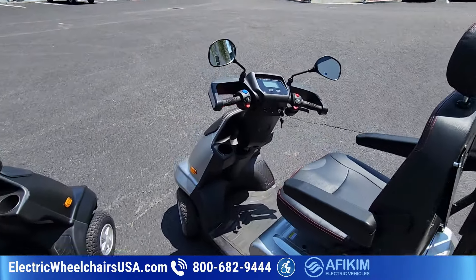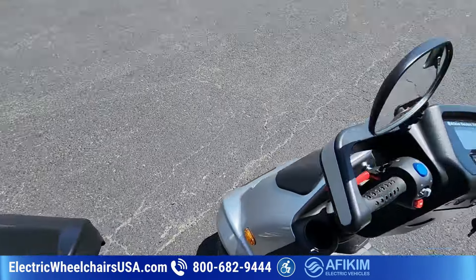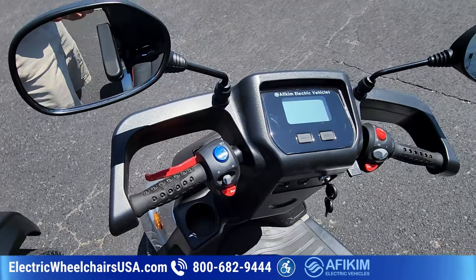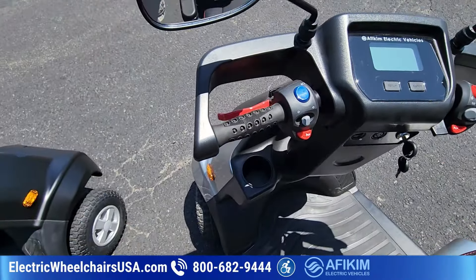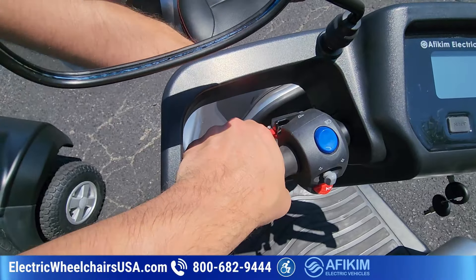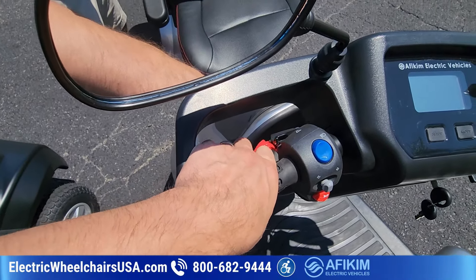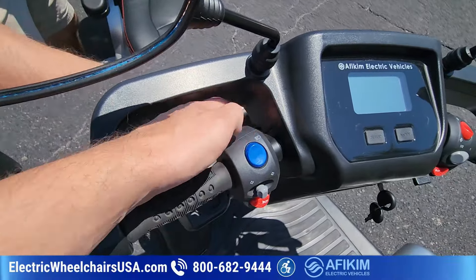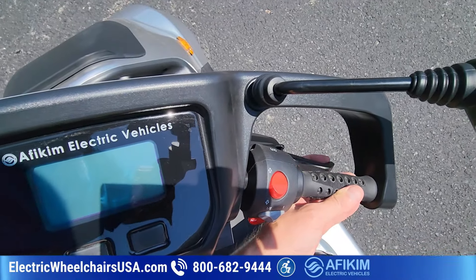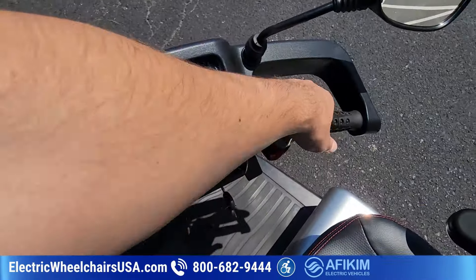You might notice there are mirrors on this one — adjustable rear-view mirrors come standard on both models. The brakes are electromagnetic, which is pretty common on most mobility scooters. When you let off the throttle, the brakes automatically engage, so there's no hand brake. You'll see this red lever — this is an emergency or supplemental brake. In Europe it's required on all recreational scooters even with electromagnetic brakes, but here in the US it's not necessary, so you'll probably never use it. You accelerate with the throttle on the right side. If you're left-handed, we can switch it to the other side — just let us know before ordering.